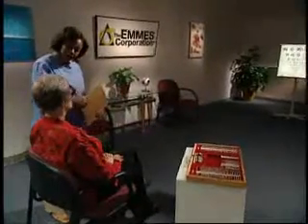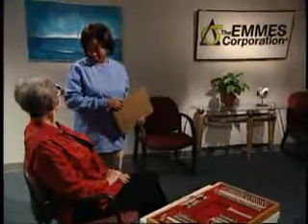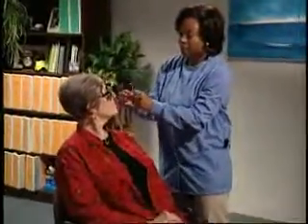And when it becomes evident that no further meaningful readings can be made by the subject, despite the examiner's best effort to get the subject to guess, the visual acuity testing for that eye is now finished.